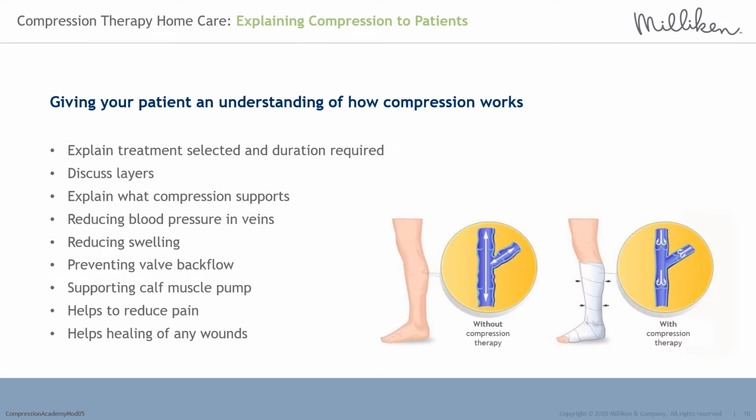Explaining compression to patients. Giving your patient an understanding of how compression works. We need to explain why compression bandages, garments or devices have been prescribed for our patient, what the compression's role is in their healing and recovery journey, and that it is normal for the type of compression to change throughout this journey. The key message being the importance of the compression and it being fundamental to their recovery.